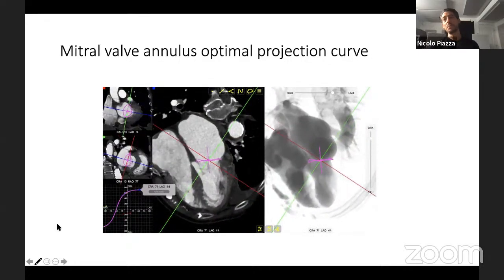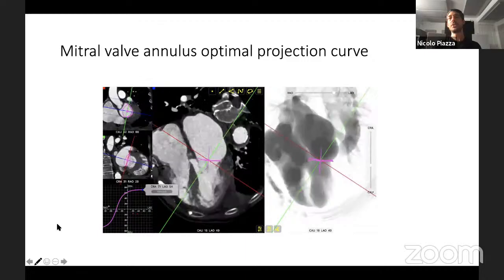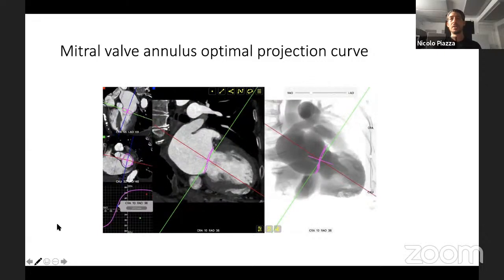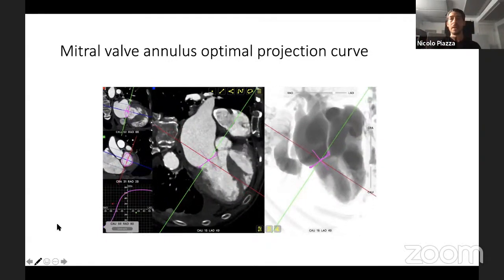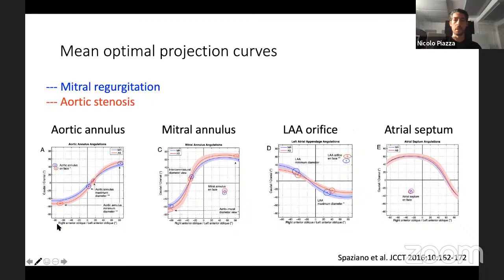Also remember from last week that as you drive along the S-curve, you're driving across the fluoroscopic grid. As you're driving across the fluoroscopic grid, you're going to come across different chamber views. And so now you can start to combine chamber views and S-curves and try to get the best chamber view with your structure in plane or en face in order to perform your procedures.